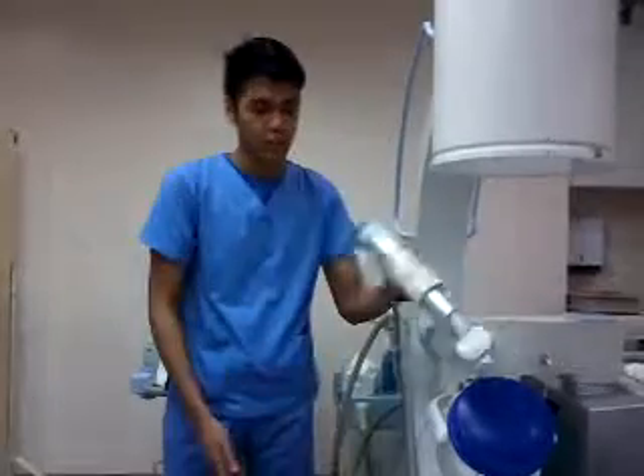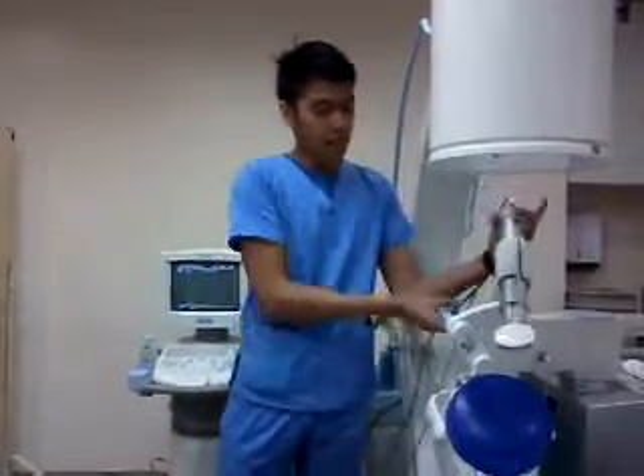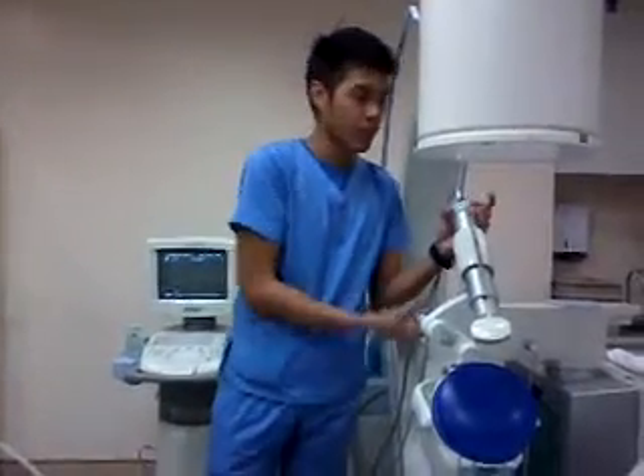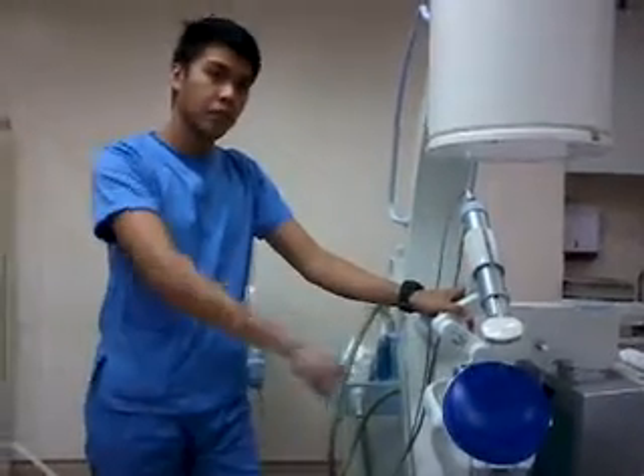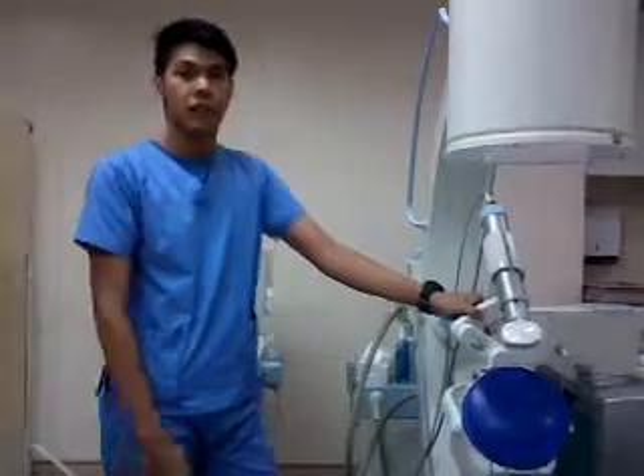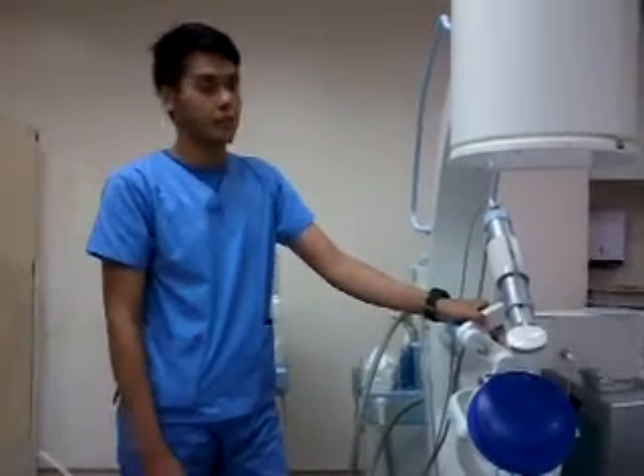The probe movement here will only be transverse — unlike in other normal ultrasound procedures where you can move up, down, left, right, transverse, or any direction you want.